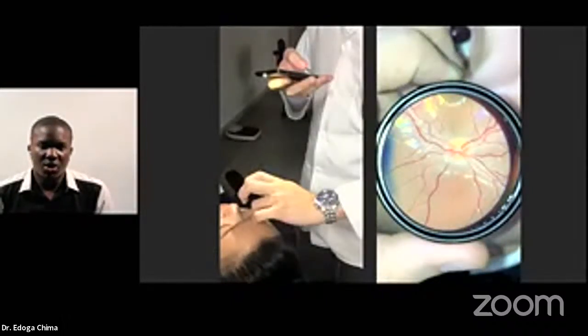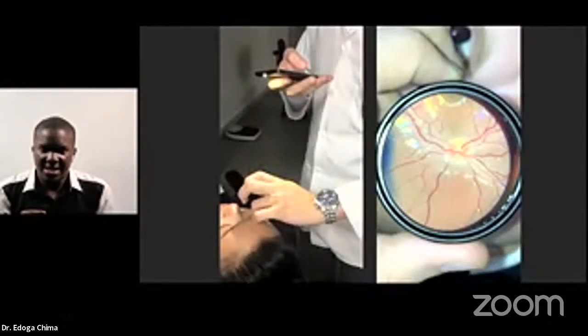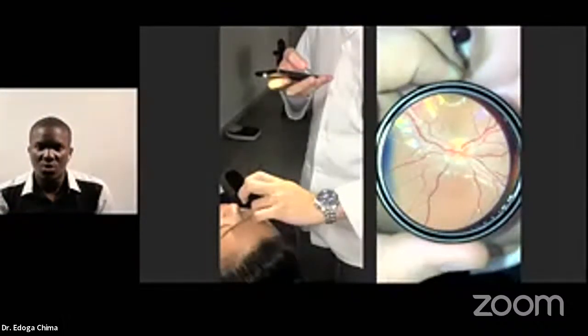Because using an indirect lens, the image will be vertically and horizontally inverted. If I stay at the head of the patient, I'm going to see an image that is reversed, so that vertical and horizontal inversion is going to be reversed. I will now have a clear picture as if I'm doing a direct ophthalmoscopy.